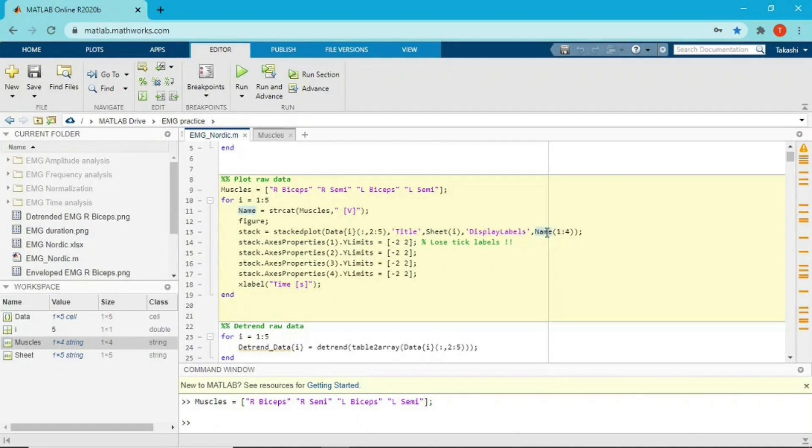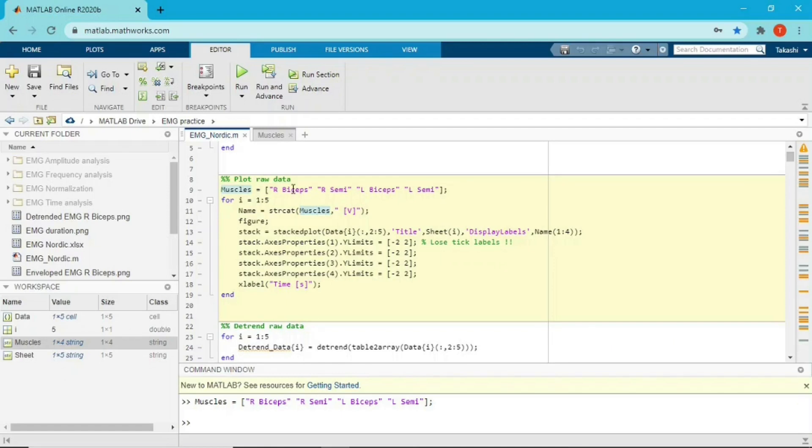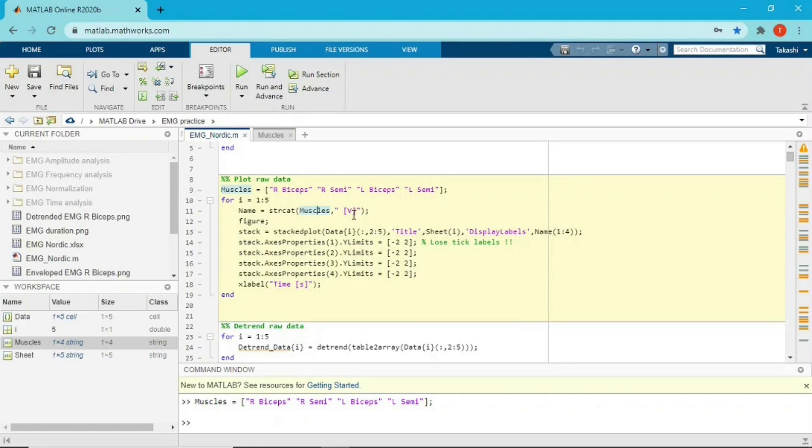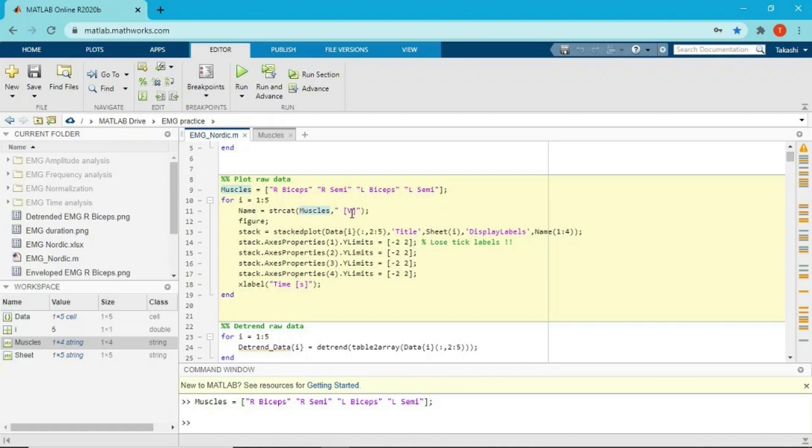So I have to explain this one. Name is the name of the variable I just created; it could be whatever. And equals strcat—strcat is a function which can combine two strings inside the brackets. So first input argument is variable called muscles, which I just created, and what I'm gonna do is combine the name with square bracket V, which means volts, because EMG unit is volts. So what I'm gonna create is right biceps space square bracket V, right semimembranosus space square bracket V, and for the left side or left legs.